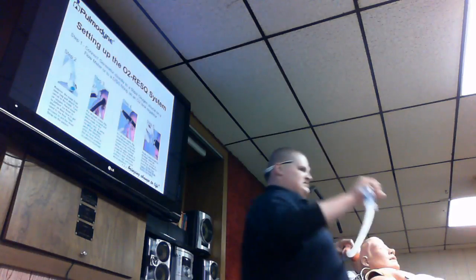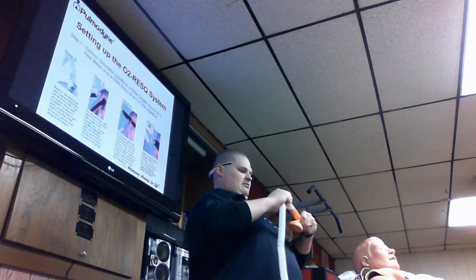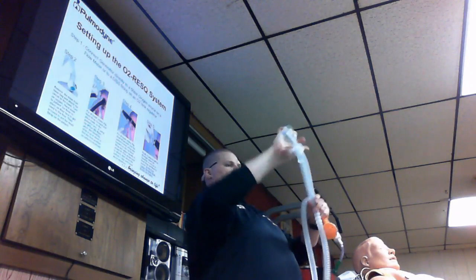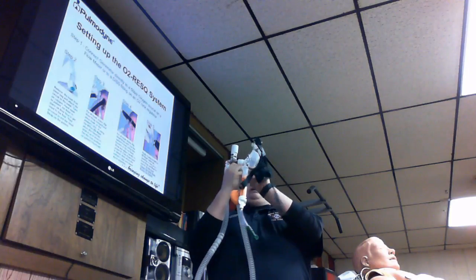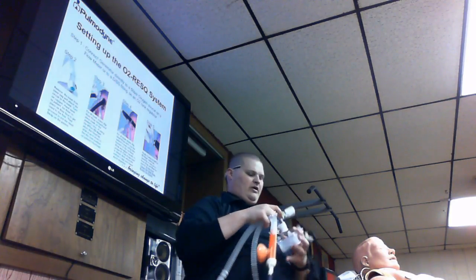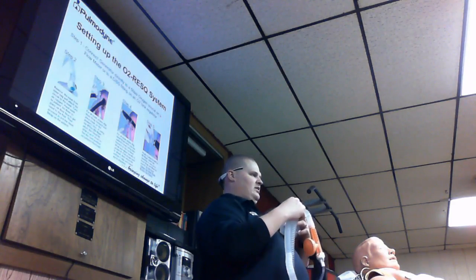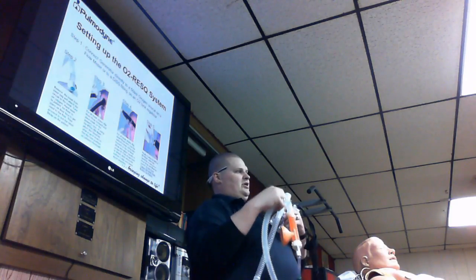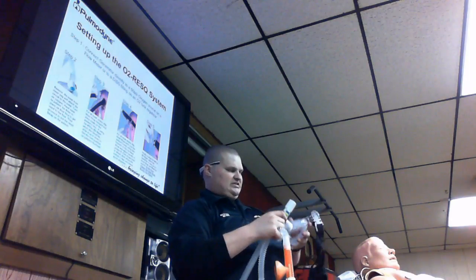We got our pieces, that connects on right there. You got your extendable tube, steps out just like this. Then you got your adapter. This goes to the face piece right here. Okay, so you can take that, be able to connect it on just like that. Then our dial right here on the sides got 5, 7.5, and 10. We leave our setting at 5, and then we go adjust from there. So if somebody's still not catching on, you can adjust the pressure and go from there. You don't want to start at 10 and have to back off, start at 5 and increase as needed.